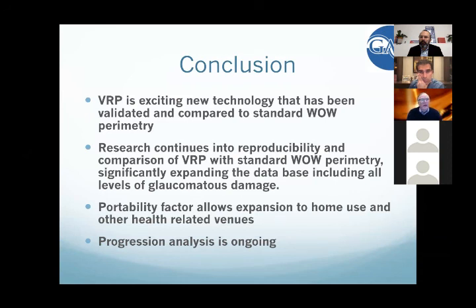This is very exciting. And it's very exciting to have my own patients that I've known forever, and see the correlation. That's really fantastic. Now, the research will continue into reproducibility. It'll be interesting to know what the frequency-of-seeing curve really looks like with some of these people. Maybe that research can be done.